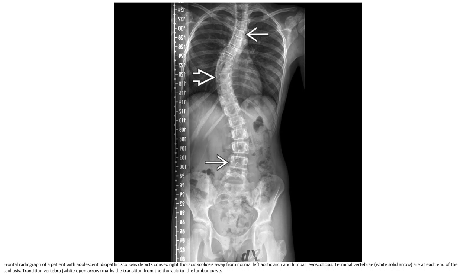This is a radiograph of a patient with adolescent idiopathic dextroscoliosis. There is a convex right thoracic scoliosis away from the normal left aortic arch, and lumbar levoscoliosis. Terminal vertebrae are at each end of the scoliosis. Transition vertebrae mark the transition from the thoracic to the lumbar curve.